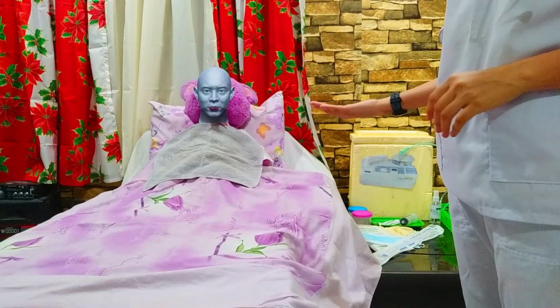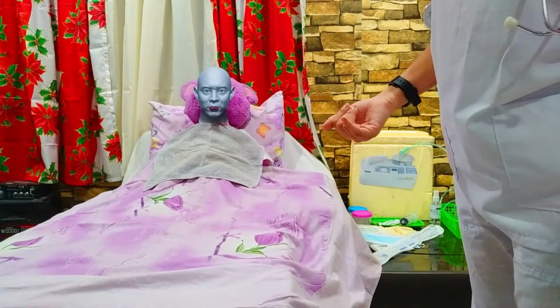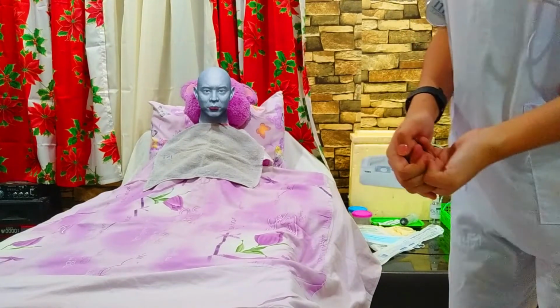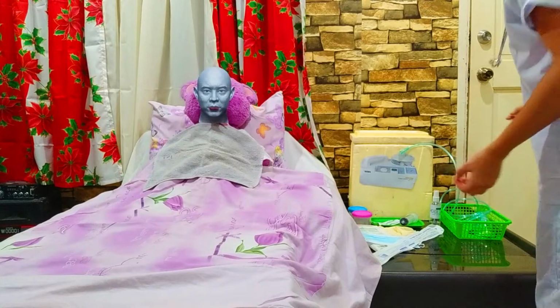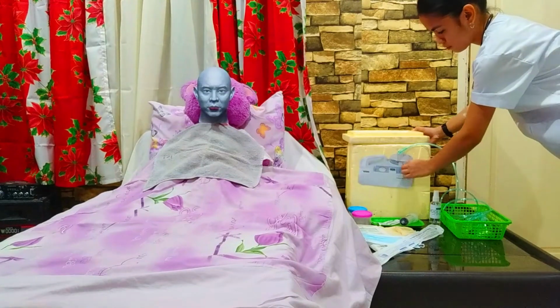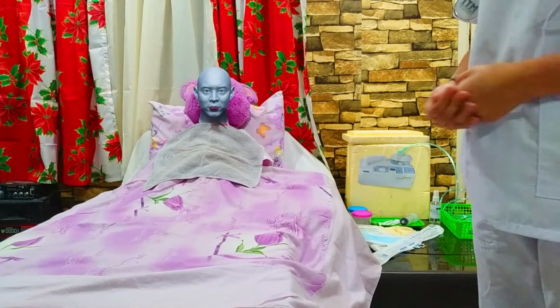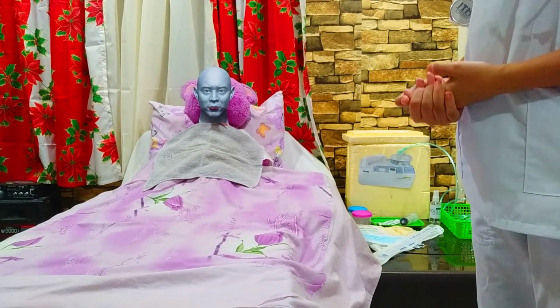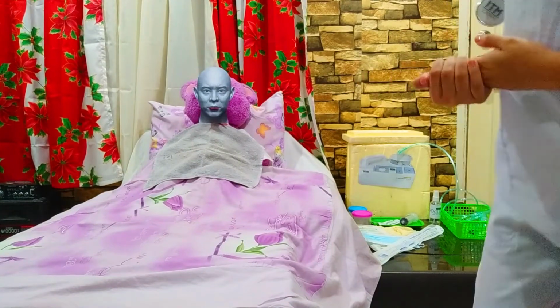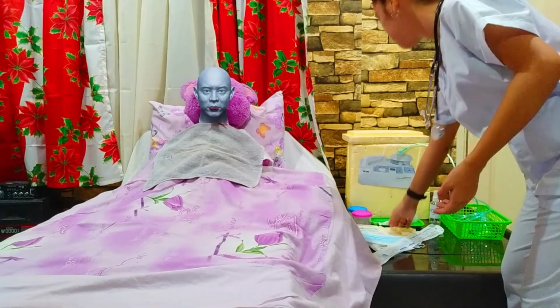Since my client belongs to the adult or adolescent period, we need to adjust the suction to no more than 150 millimeters of mercury. And then we need to put on a clean glove and occlude the end of the connecting tubing to check the suction pressure.